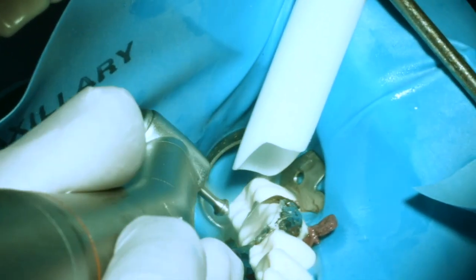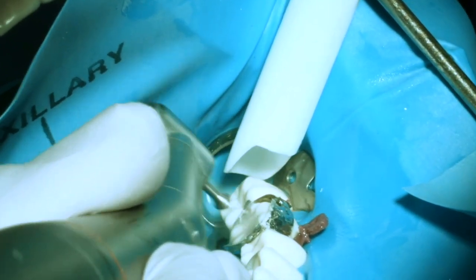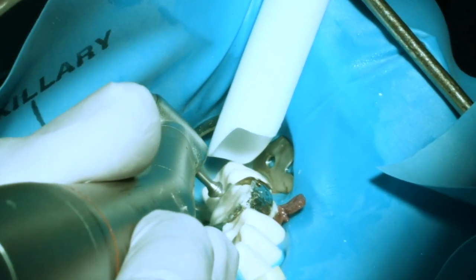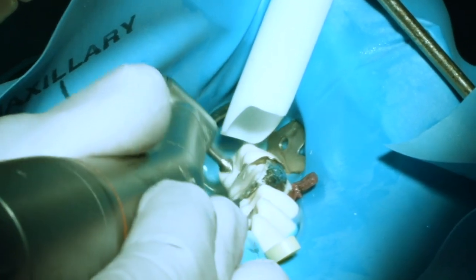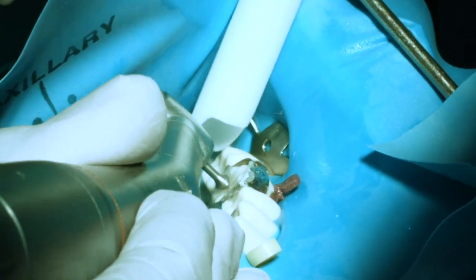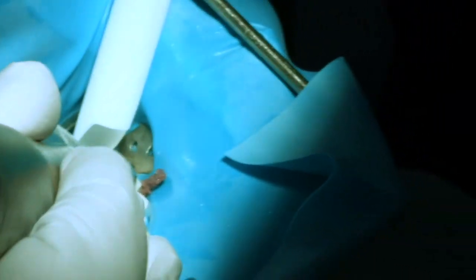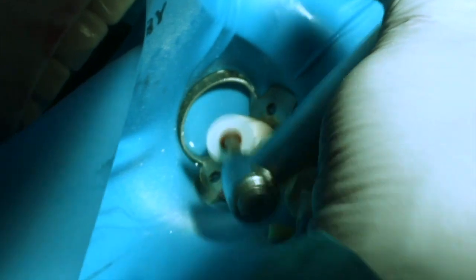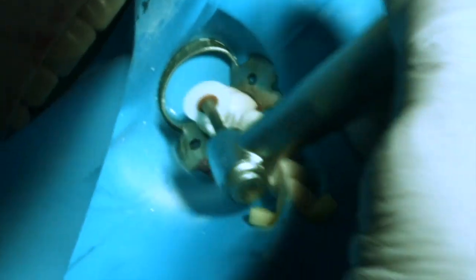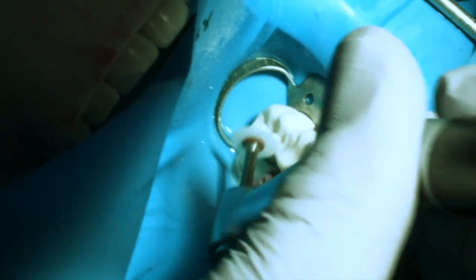I'll place the 50 micron acorn burr with the limit stop and safe edge into the occlusal pit areas. The safe edge protects the enamel, while the limit stop prevents me from carving too deeply, so I don't over-reduce the tooth. Once I'm satisfied with my crude anatomy, I'll switch to the 15 micron Christmas tree-shaped burrs to finish and polish the surface. Then just for completeness, I'll use my pop-on finishing disc to finish the marginal ridge and proximal areas. If necessary, I'll go back with my small 15 micron acorn burr to create some really fine anatomy without scarring the enamel.